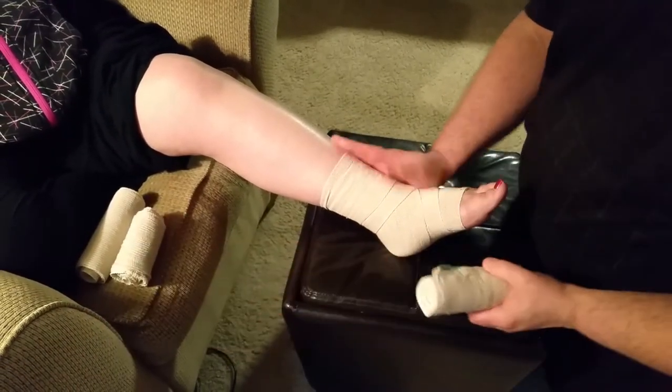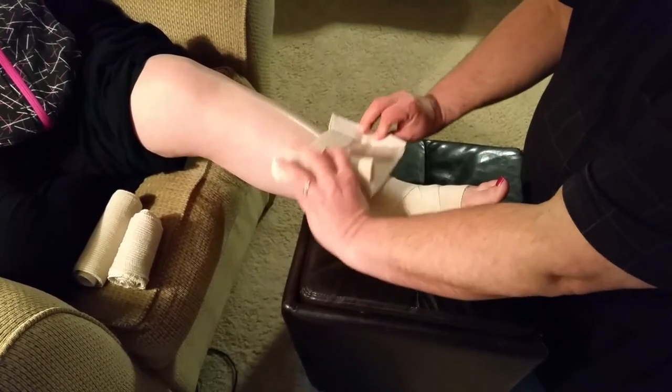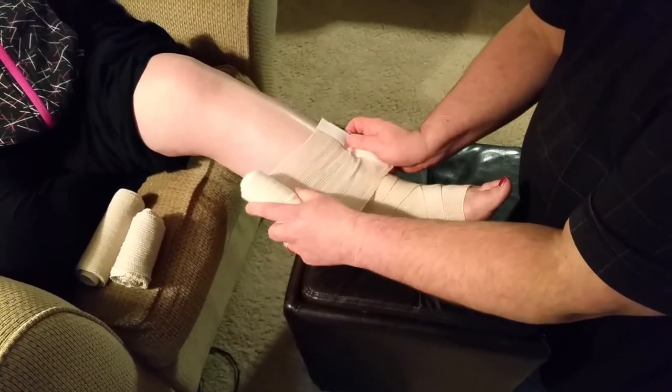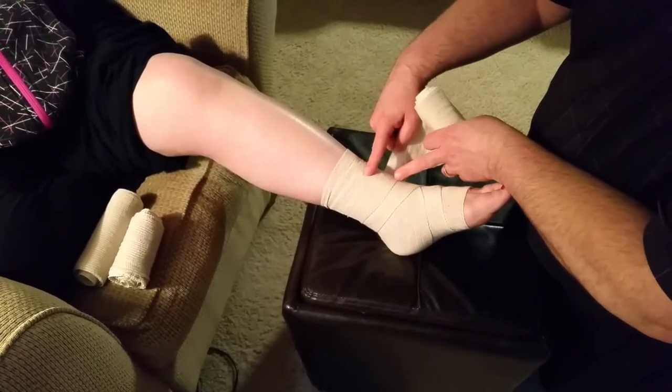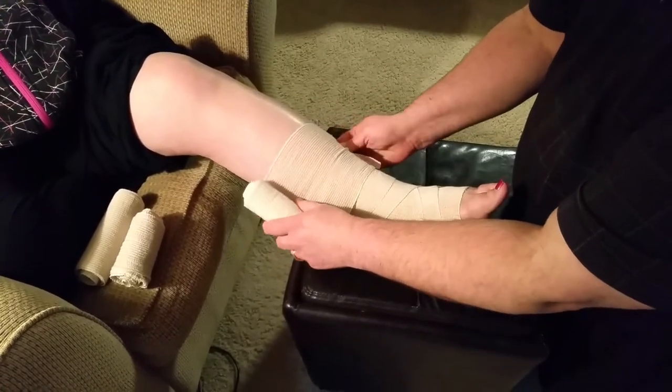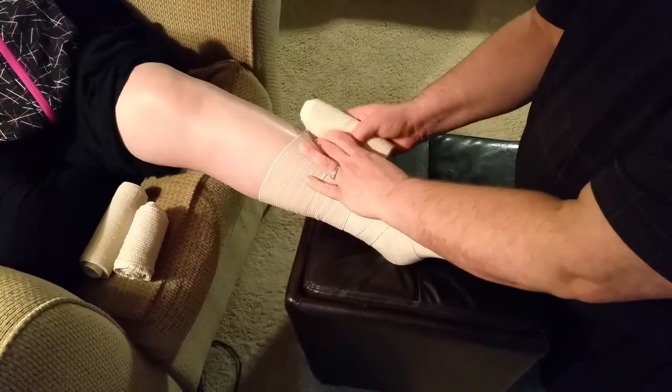Then using a larger wrap on the main part of the leg, come across again velcro side up. You hit at 50% overlap — so it's coming down 50% over that — then come around and seal.